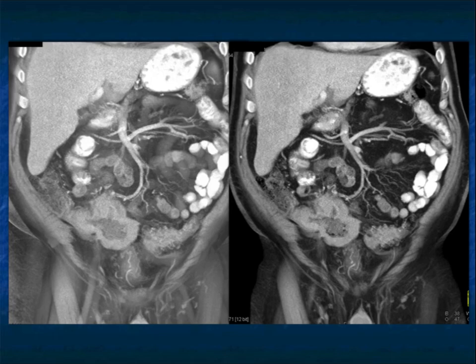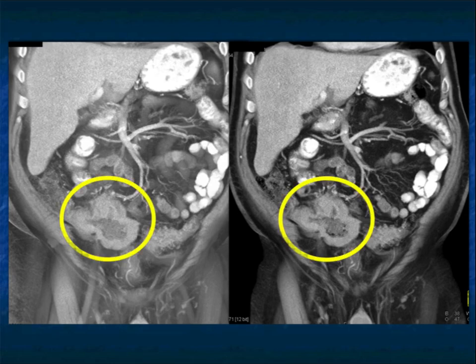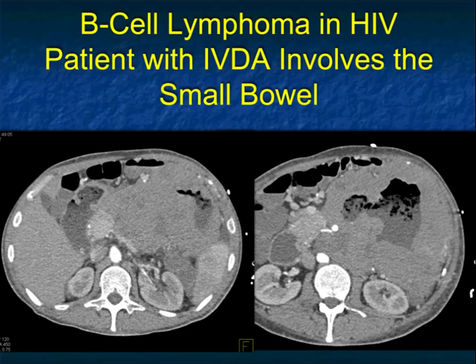One of the concerns with lymphoma, particularly regarding chemotherapy when lesions are large, is that tumors can involute quickly, necrose, and perforate. So you have to be very careful when they do therapy. Sometimes these B-cell lymphomas, particularly in HIV patients, are humongous.